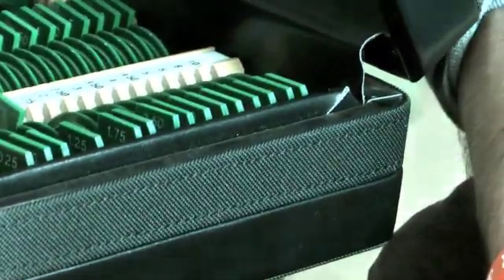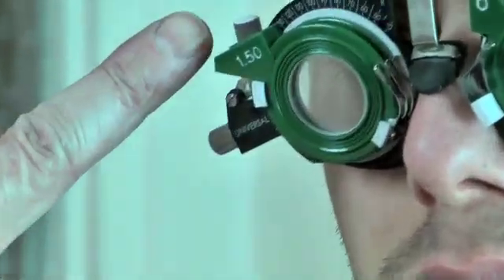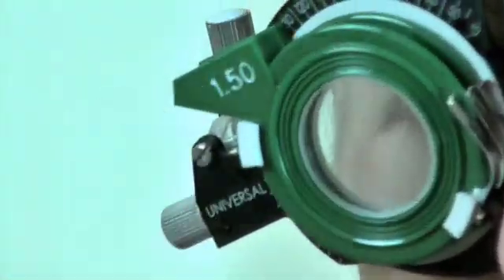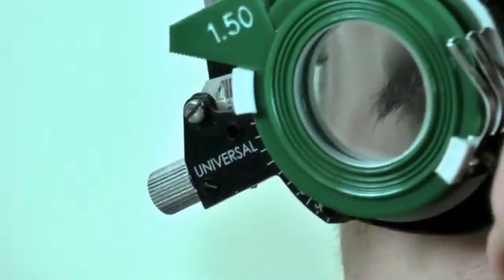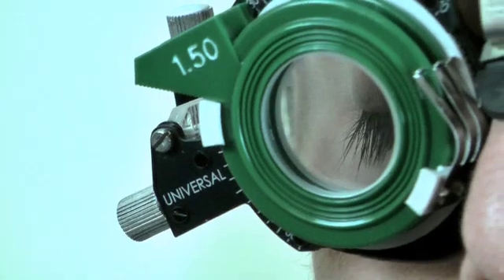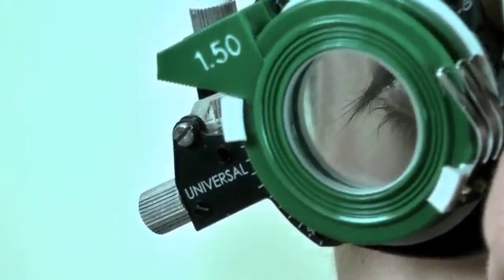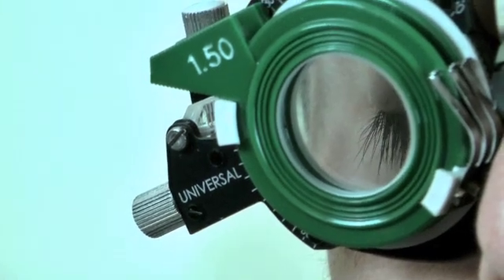You can see 1.50 is written on the actual lens. So he's now wearing 2.50 - the plus one that we put in to begin with, plus another 1.50. And if he says that's better, then we can just try a very weak lens, maybe a 0.25.